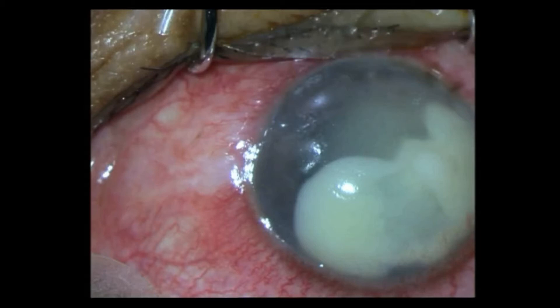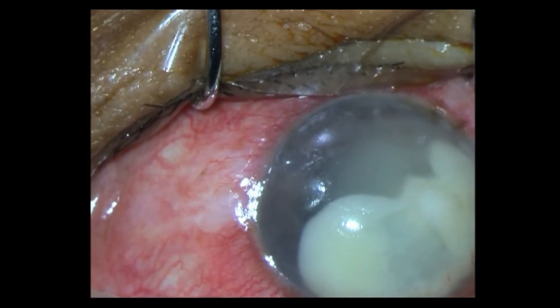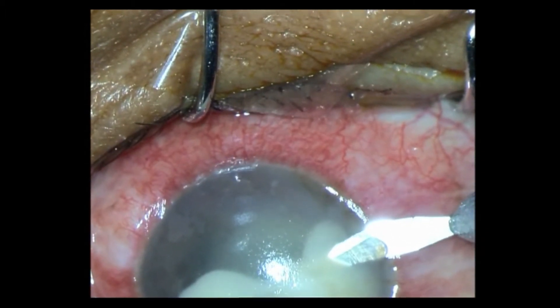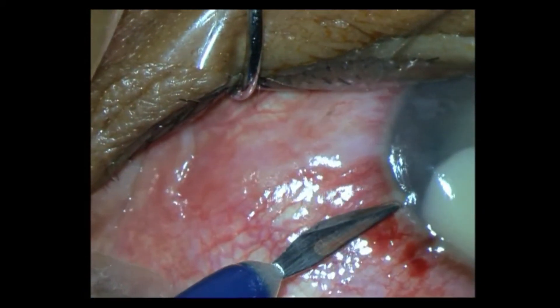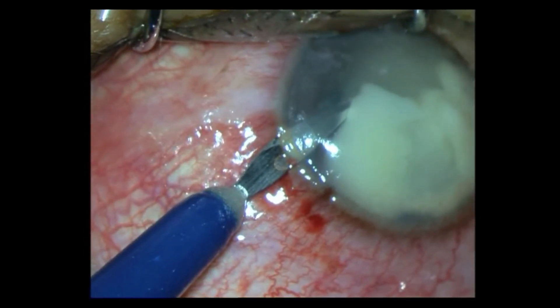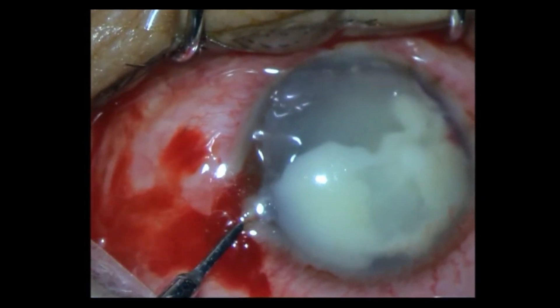Finally we decided to go ahead and evacuate the chamber of this organized hypopyon, and this is how the surgery went. Initially, under local anesthetic, I am putting in two paracenteses. My plan is to put in an anterior chamber maintainer from one side, pressurize the chamber, and try with that pressure to evacuate the chamber from the other paracentesis. There are the two paracenteses, and here is the anterior chamber maintainer.